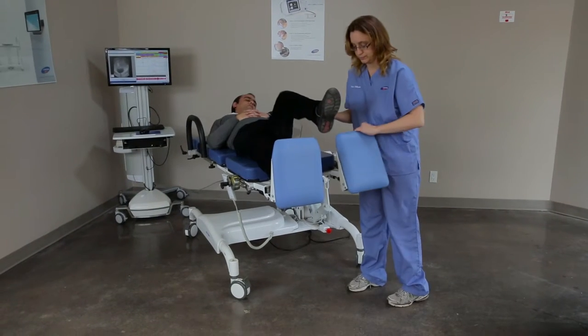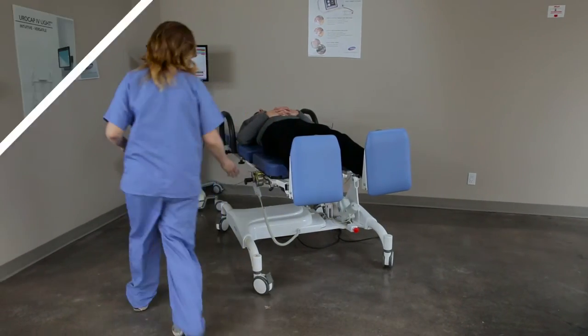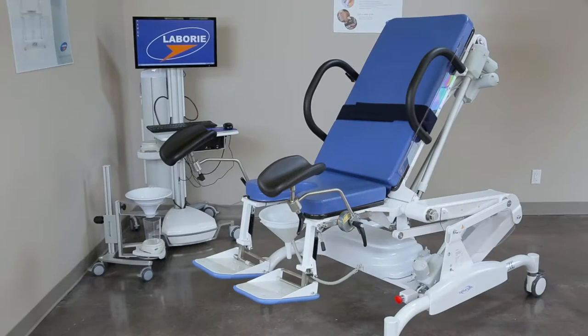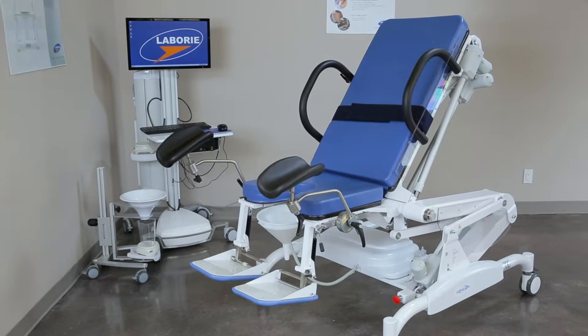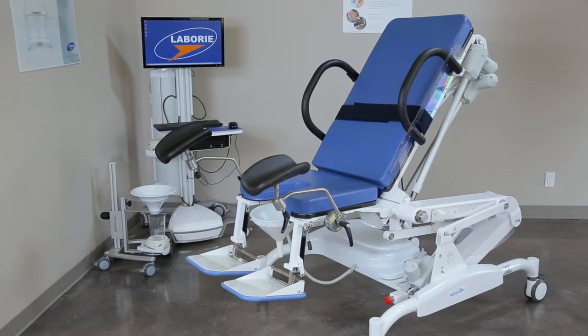To raise the patient to a standing position, first lower the footrests and place their feet on them to ensure they are secure during the movement. Finally, return the table to a lowered seated position and shorten and raise the footrests again to allow the patient to stand up from the chair.